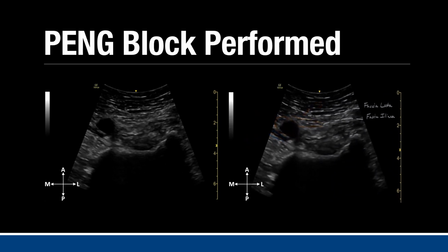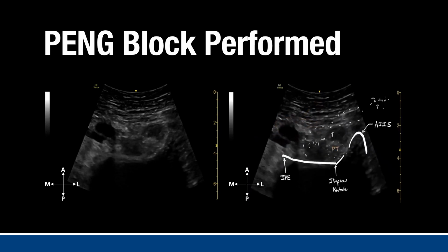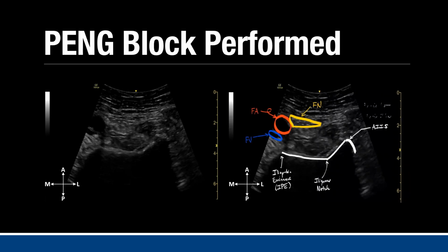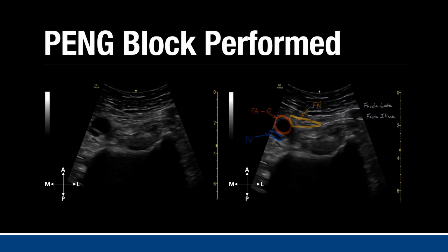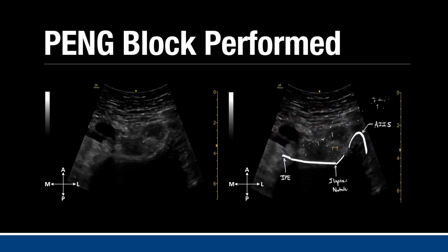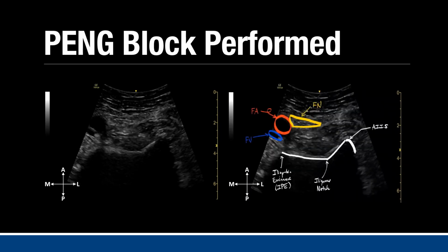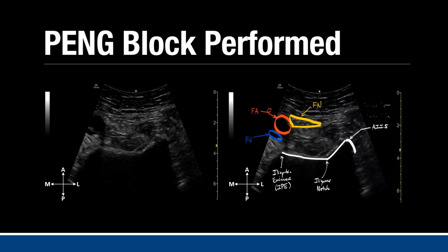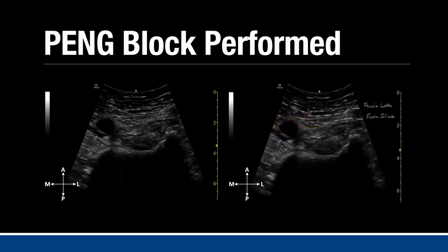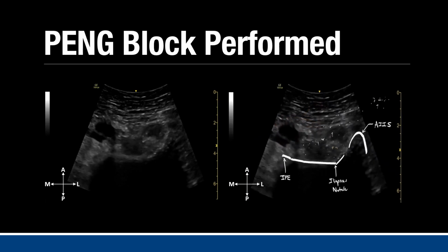This slide depicts the relevant anatomy again for review. You should practice visualizing the anatomy in the unlabeled version and using the labeled version for confirmation of knowing which structures are which. You may notice it is slightly harder to identify structures with the low frequency transducer and in someone with less than ideal habitus and anatomy.